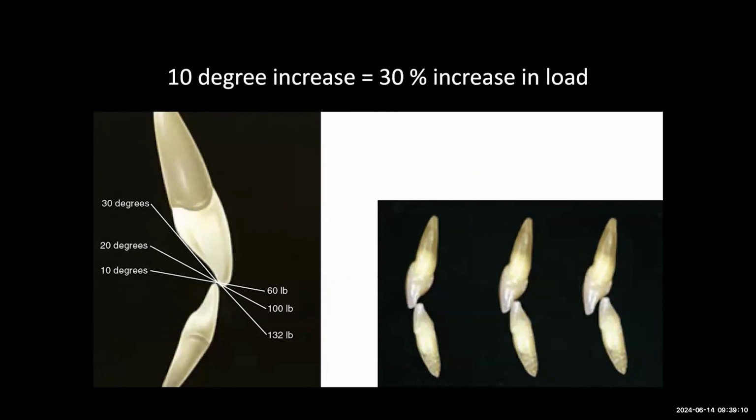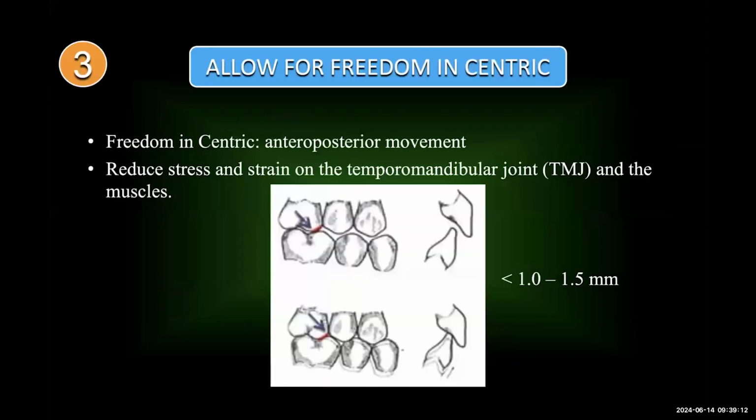So that's rather significant. Number 3, allow for freedom in centric. I talked about that.